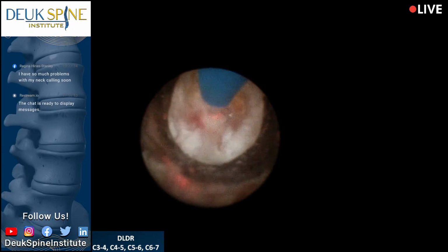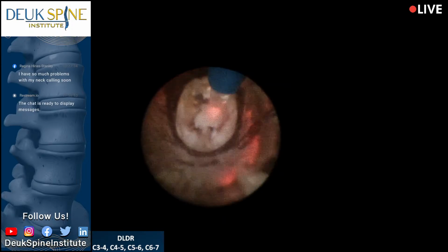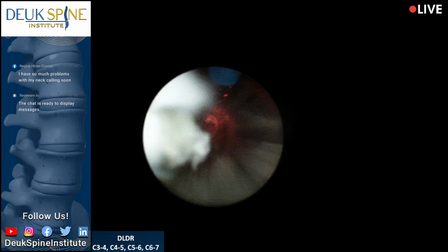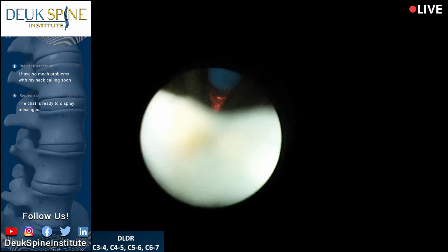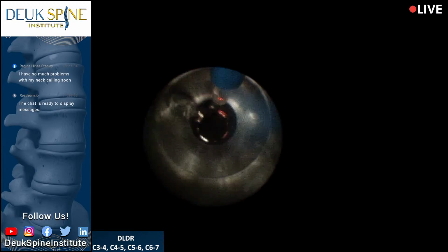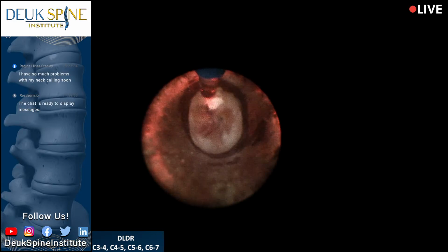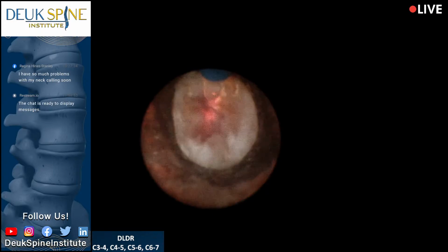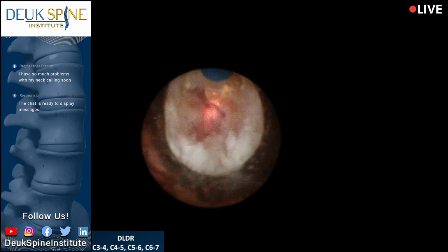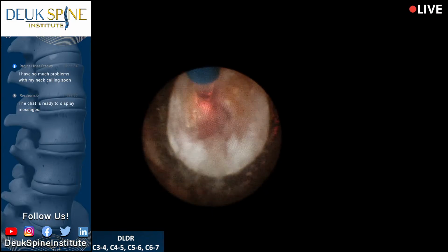And you see I'm working beyond the tube. I'm going beyond it. There's a piece of herniation right there. There it is. Came out. Bam. Nice, huh? It's the little things in life that matter, right? The little joys. Like little pieces of herniation coming out. That's what gives me joy.